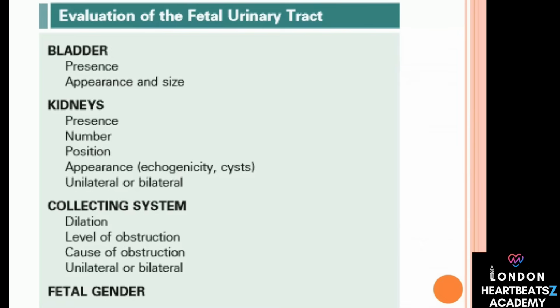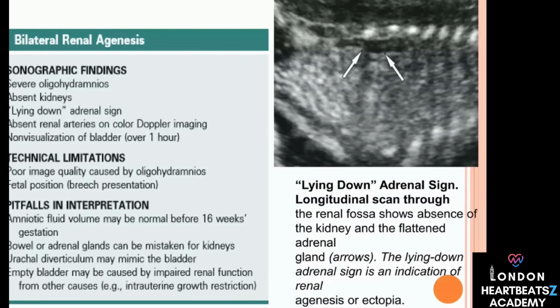And as other sources on congenital anomalies note, failure to visualize a kidney at all, renal agenesis, or identifying a kidney that's completely replaced by multiple non-communicating cysts, multicystic dysplastic kidney or MCDK, are significant findings to look for. So checking for the presence of both kidneys, their size, any signs of fluid backup in the pelvis or bladder, and ruling out cystic changes. Are there specific signs for a missing kidney? How do they spot that?